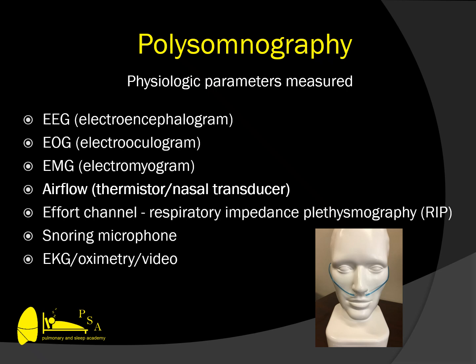The gold standard would be a pneumotachograph, which is, if you can envision someone in a PFT lab with a clamp on their nose and a mouthpiece through which they're breathing, that would be the absolute perfect way to measure airflow, but certainly not something that's very comfortable for a patient when having the study done.